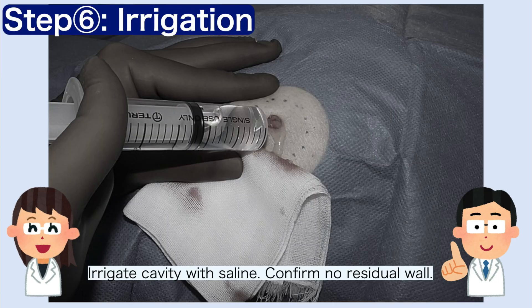Step 6. Irrigate the cavity with saline and ensure that no cyst wall remains.